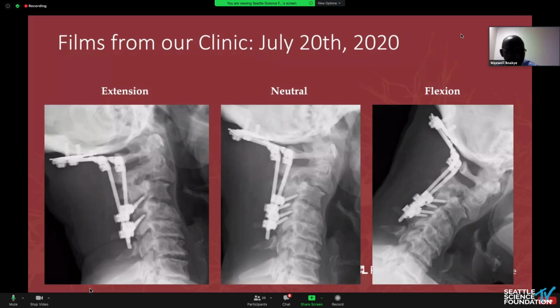I think that'd be a very meritorious idea, and I think the patient might be very grateful for that. So stopping at C1 hopefully would be possible and should be possible probably. But this is where the posteriorly placed hardware created a mess, and this is probably a very aggressive fixation that was chosen there.